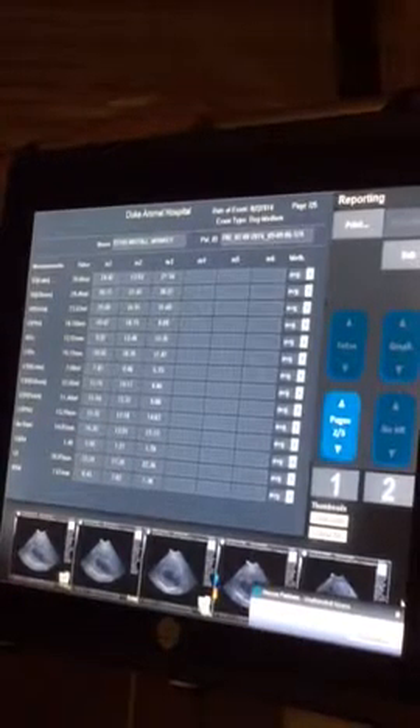We're taking a picture of each one. When the cardiologist opens this up, he's going to go to these numbers to start working up his report — or she. So it took our 1.5, our 1.2, and our 1.7, and it kind of put us at about 1.5 right in that area. Mine was 1.11 until you decided you were going to make it abnormal.